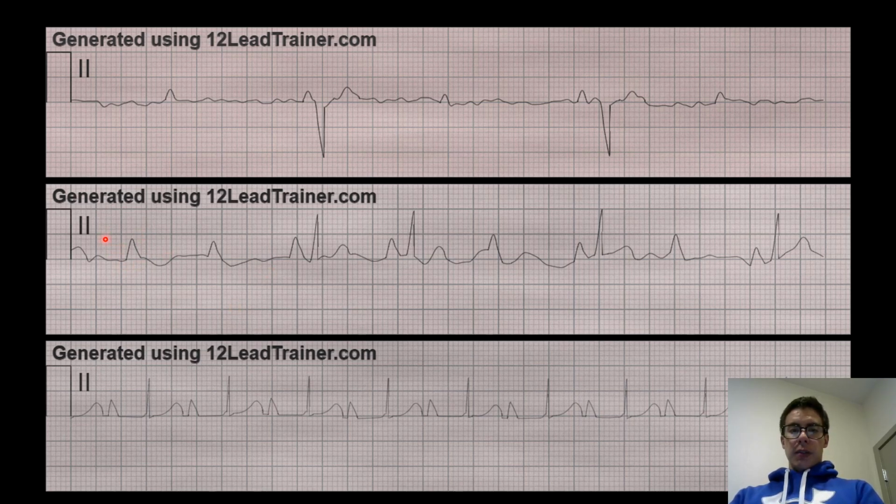But we do have a P wave there, there, and there that don't generate impulses. There is no start over of a pattern right there after this dropped one, so we think. So with a consistent PR interval, but extra P waves that don't conduct QRSs, this one right here would be a second degree type 2. And that's what also makes me think that the first one is a third degree, because I don't think I would put two of the same rhythms in a row.